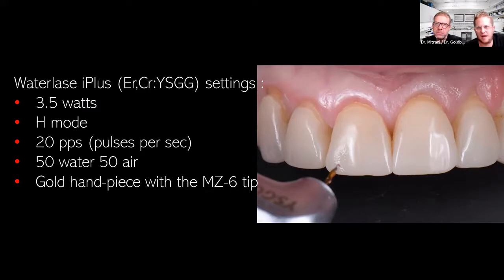This scanning method, as dentists, we're used to going pretty fast with the burr, right? We have a high-speed electric handpiece, and we have a thick burr, so we go very quickly. You have to train your hand to go a little bit slower with laser in general, to make sure that the energy of the laser gets transmitted and absorbed by the water in the cement.